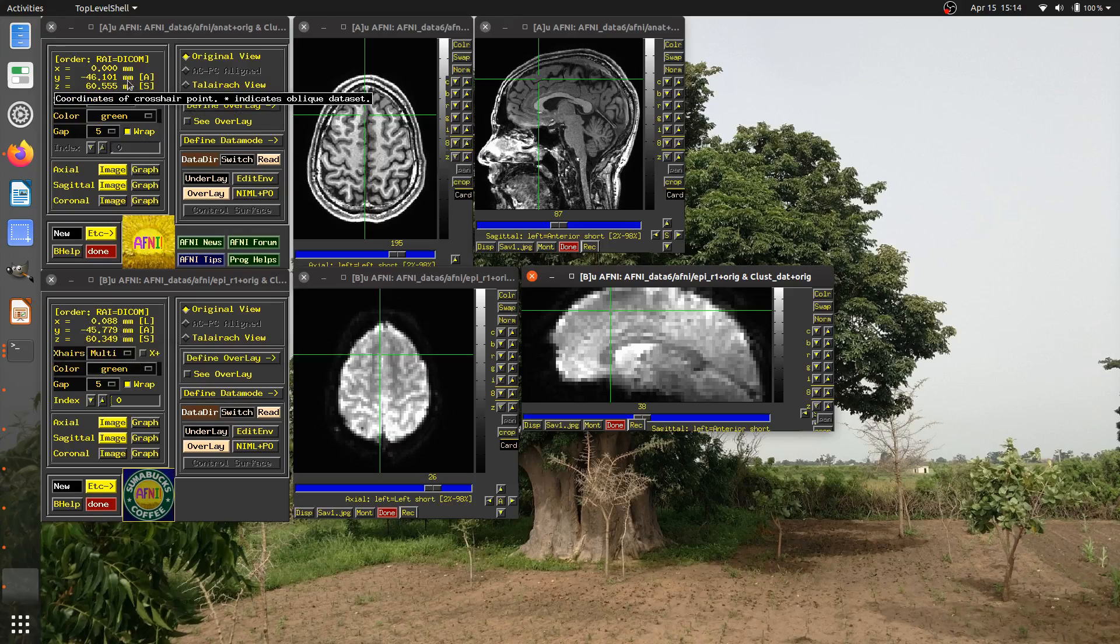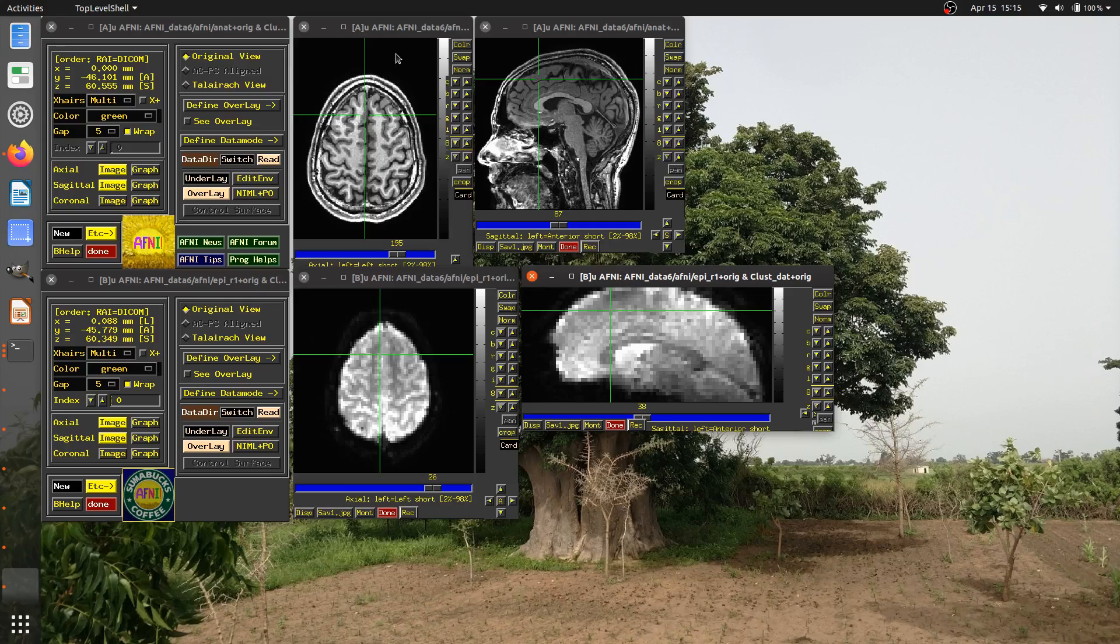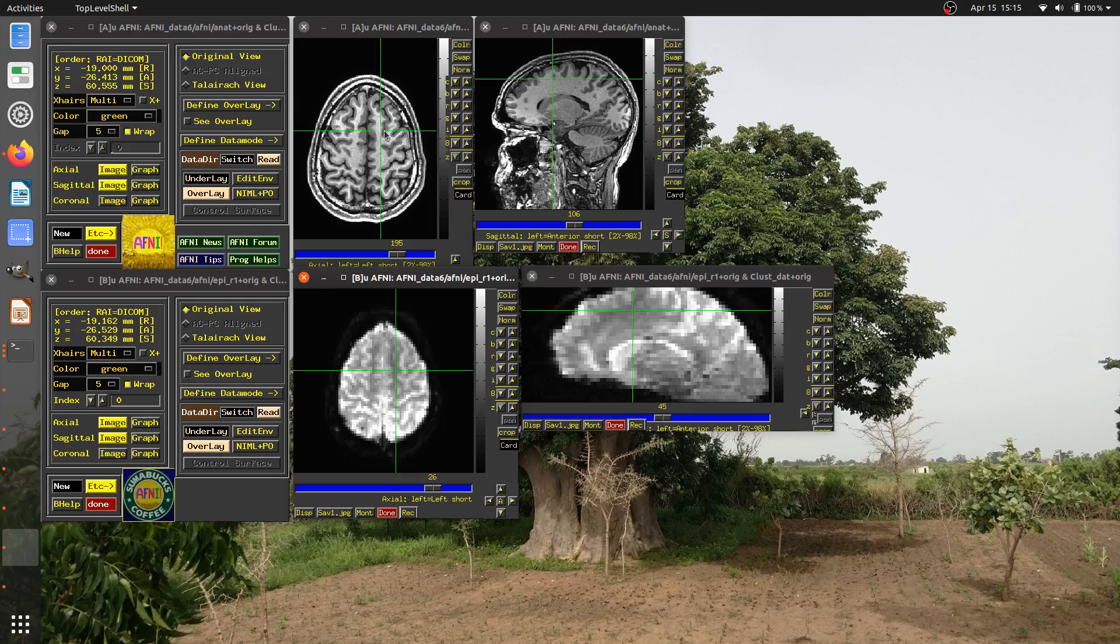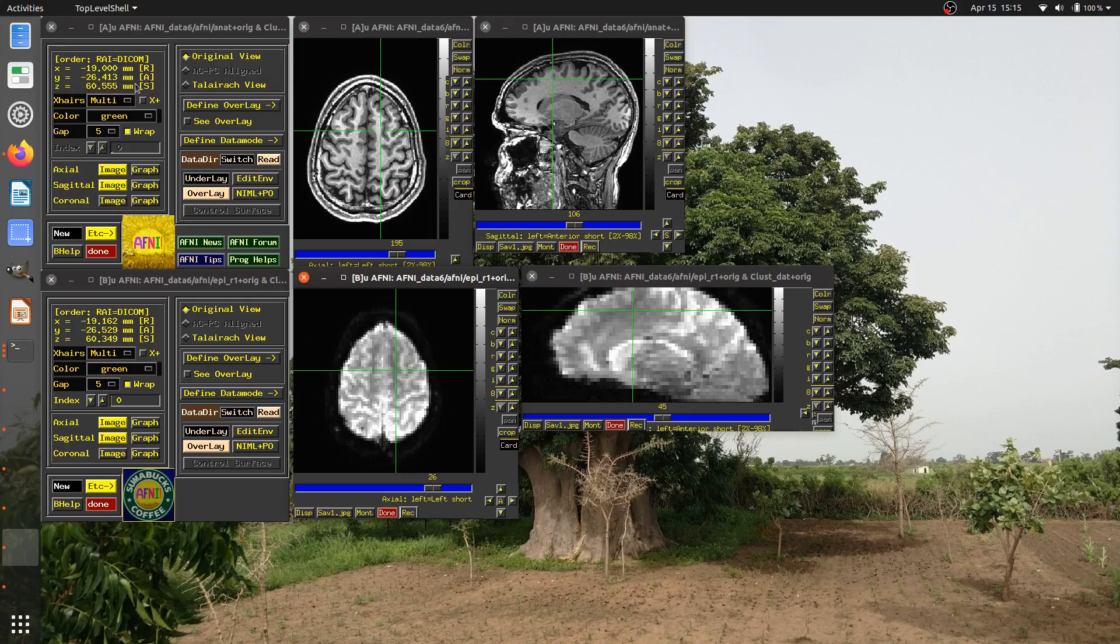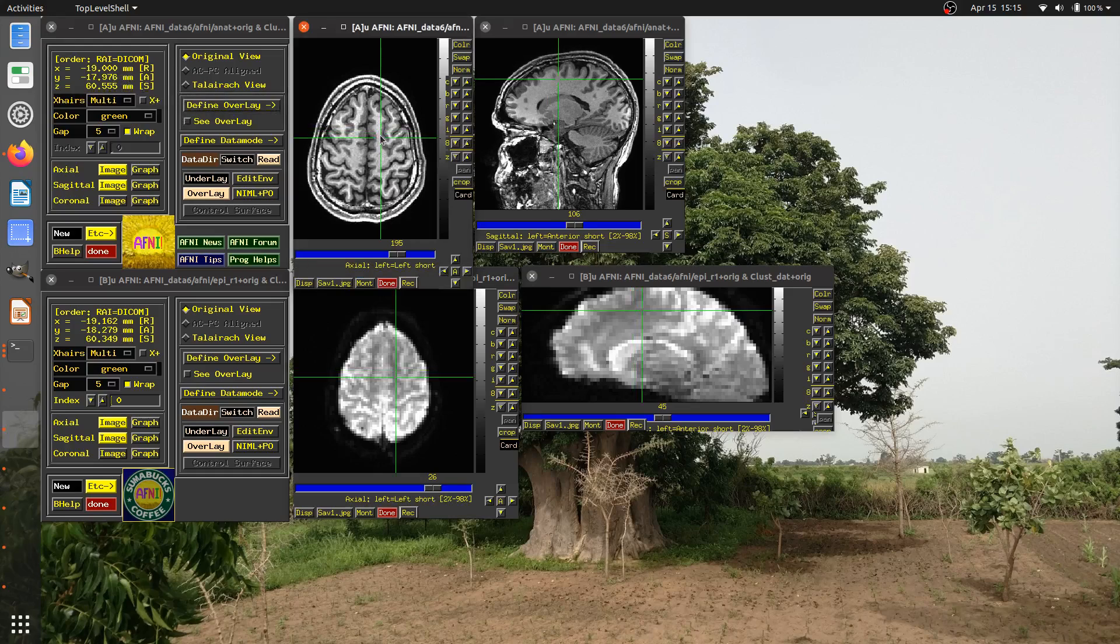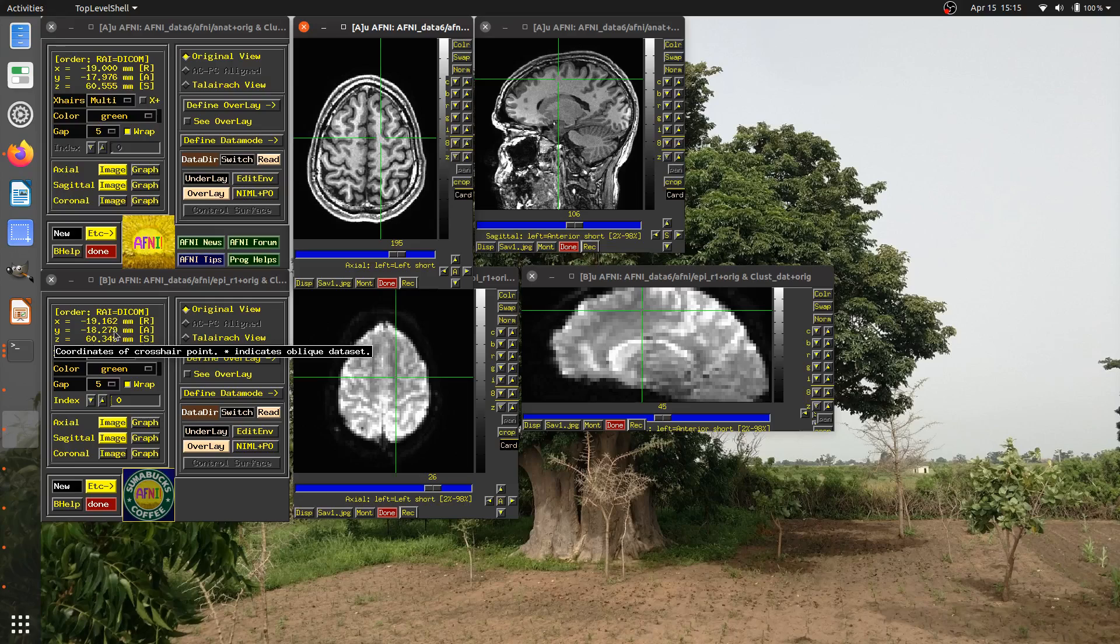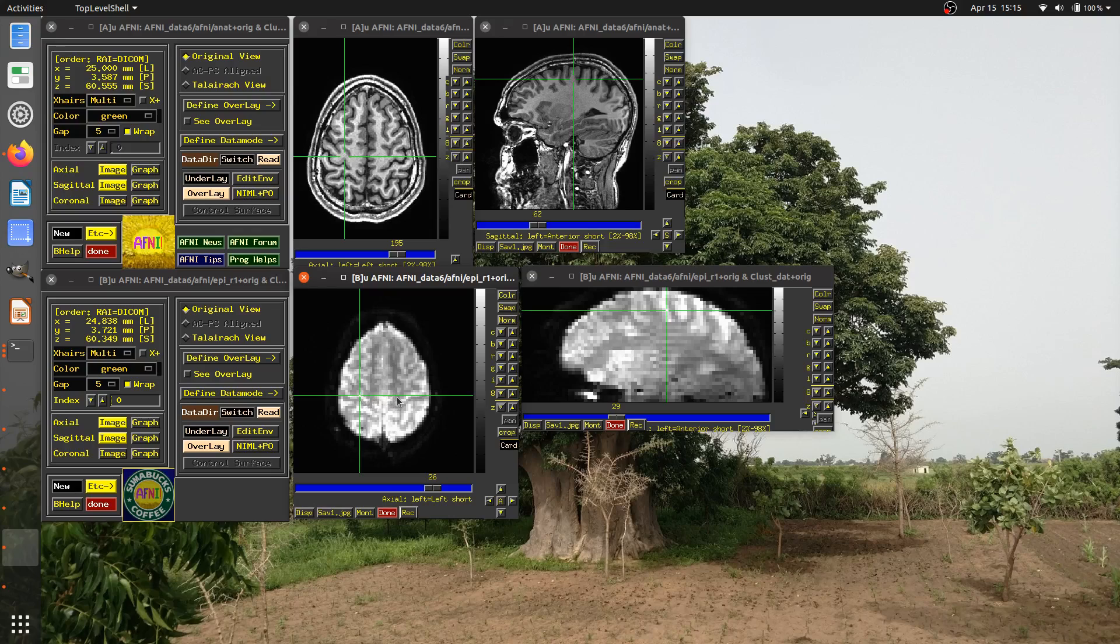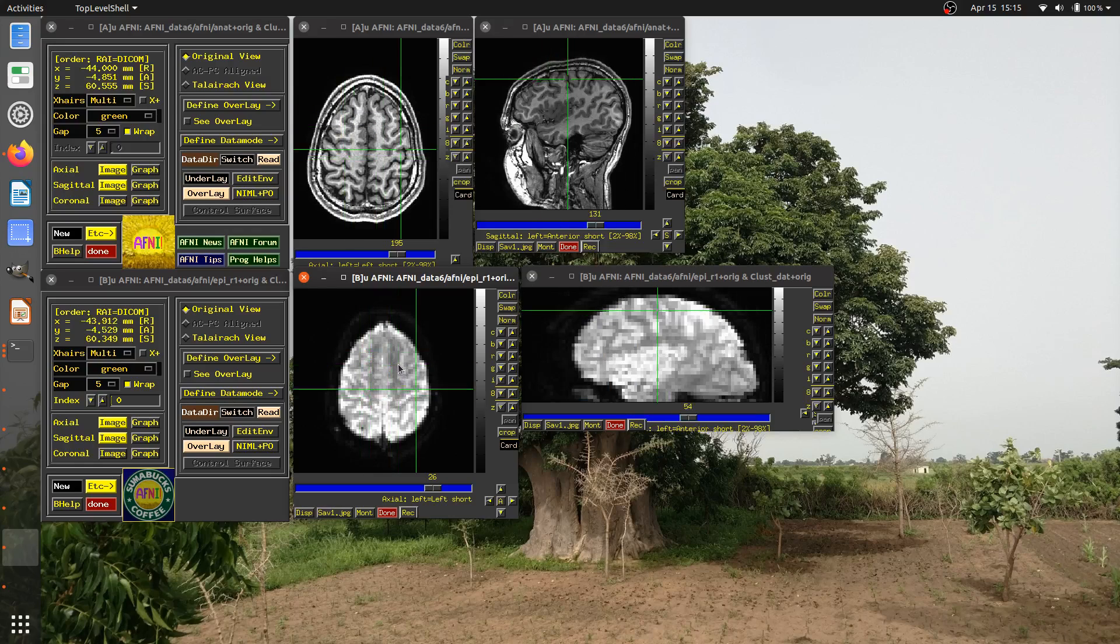Now one thing you may be asking is, why are these numbers not the exact same as this number? Well, if I open the same dataset, they would be. In this case, I have two different grids. And they have different spatial resolutions. So the grid here is approximately one by one by one isotropic. And this grid is a little bit coarser. And the centroids of each voxel are not in the exact same location. So they're locked together spatially or as close as they can be when they're on different grids.